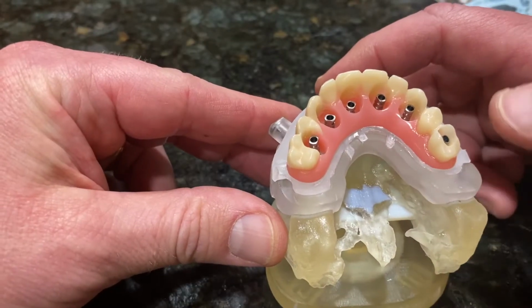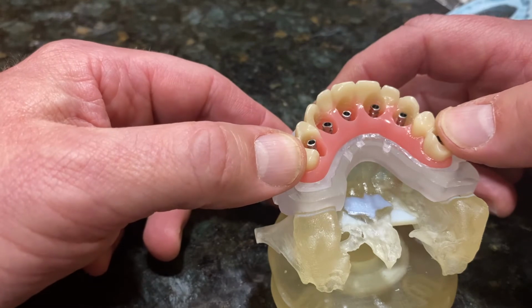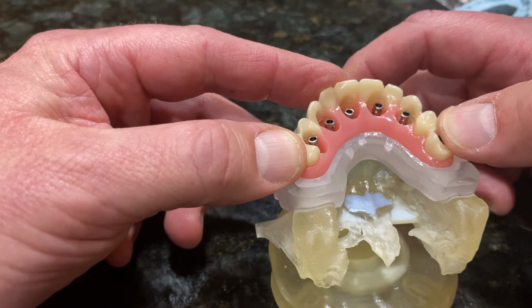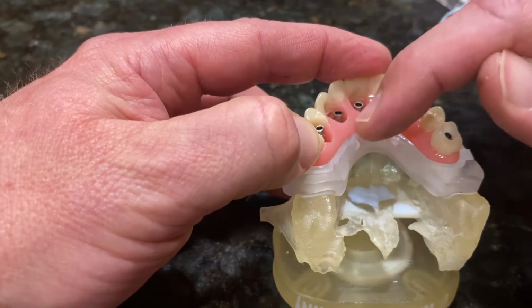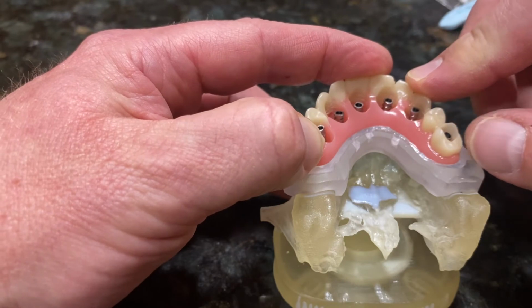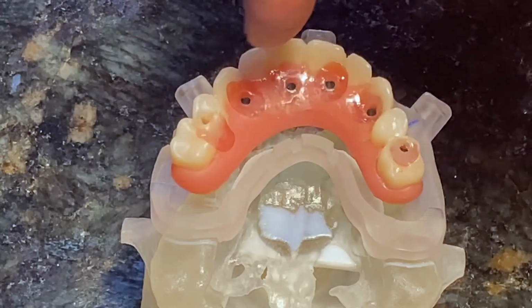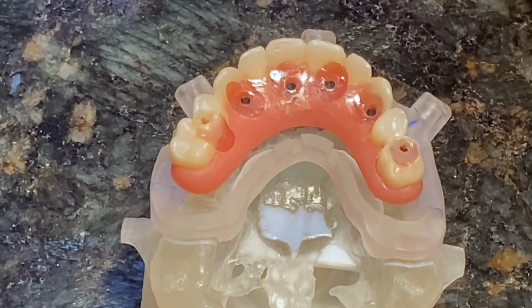There is a guide that secures the teeth, which we see here, to the correct position of the cylinders. And once that's locked in place in the patient's mouth, then we fill these holes with an acrylic that secures the teeth to the cylinders to the implants. For this to line up so exactly and perfectly, it really is a testament to the process and how exact it is, and how much better we can do.